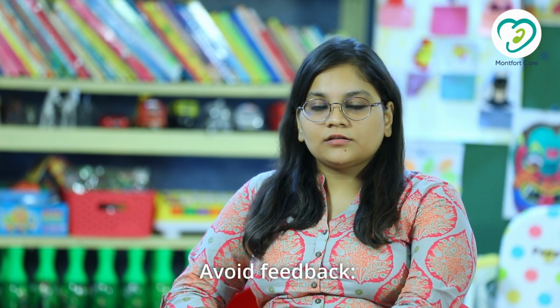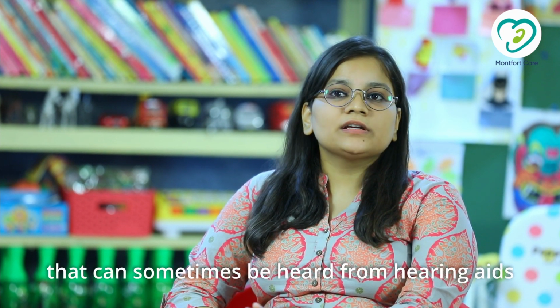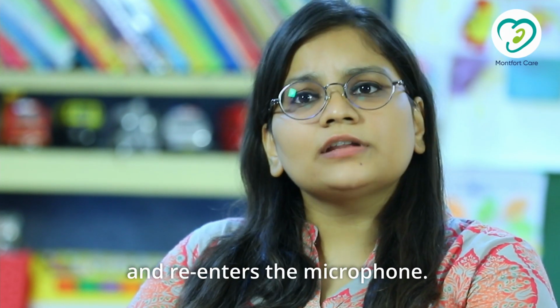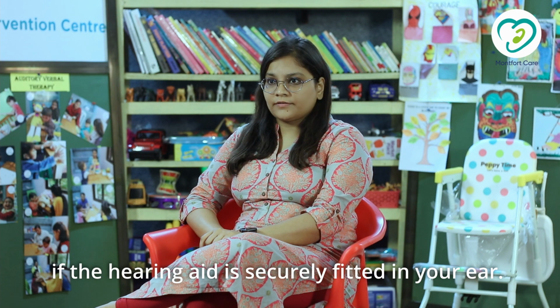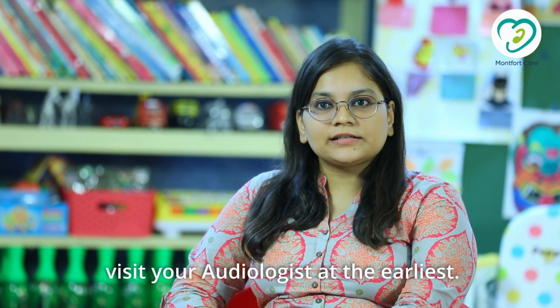Avoiding feedback. Feedback is the whistling sound that can sometimes be heard from hearing aids. It occurs when amplified sound comes out of the ear mold and re-enters the microphone. You should not hear feedback if the hearing aid is securely fitted in your ear. If feedback still persists, visit your audiologist at the earliest.